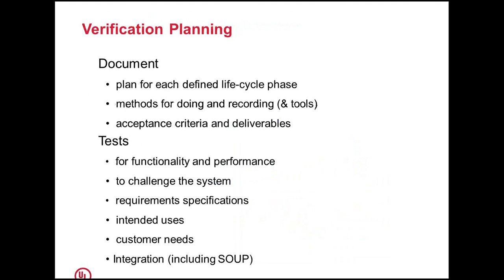Verification planning, plan for each defined lifecycle phase. When you are in a requirements phase, you can clearly specify how you are going to verify the requirements, what tools you will be using, what the acceptance criteria are, and what you will be delivering. And you will do the test for functionality and performance to challenge the system, all those things.